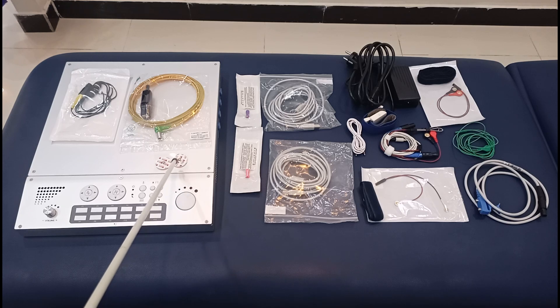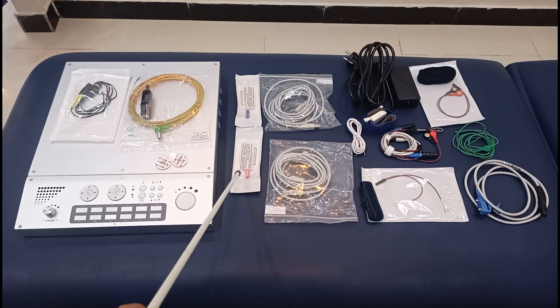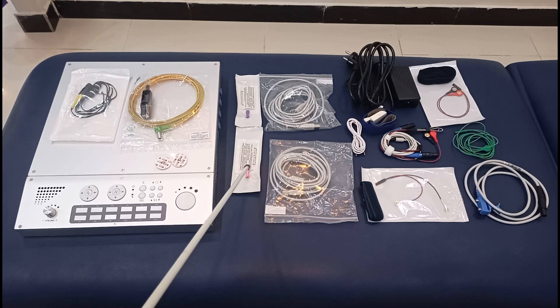These two are the electrodes — these are surface electrodes, sometimes referred to as ECG electrodes. These are disposable electrodes and they can be used to perform surface NCS and EMG if the machine allows. These are the needles for EMG — these are coaxial needles, meaning they have both the anode and cathode within the needle itself.